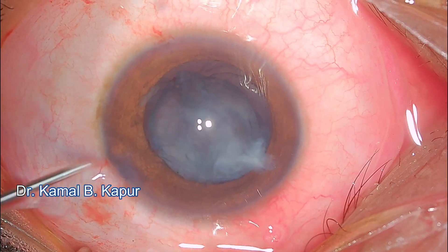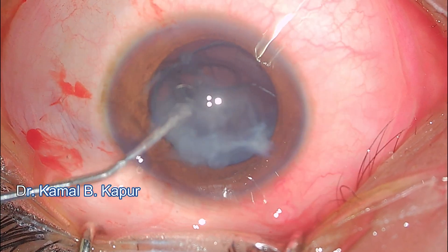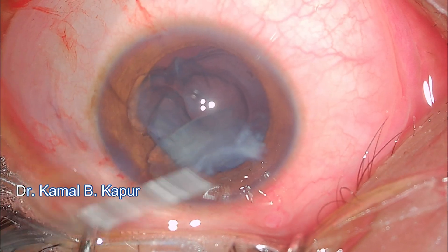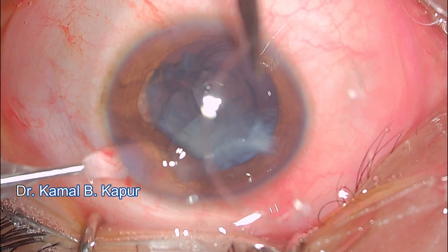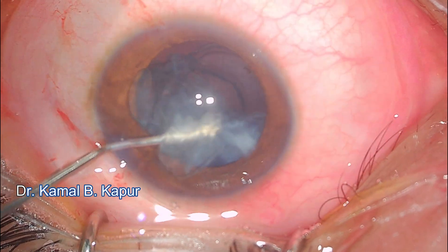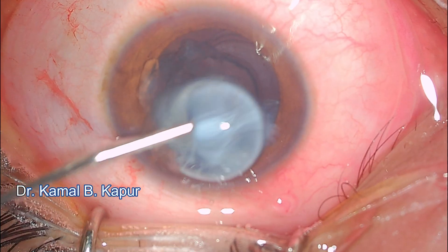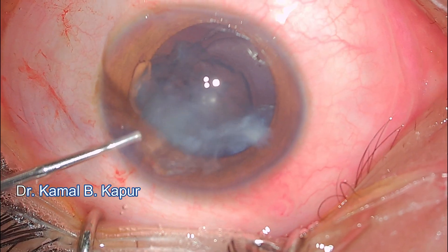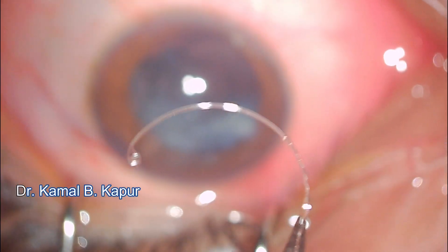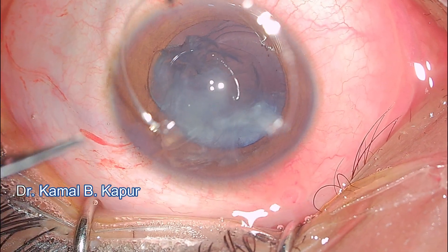I use viscoelastic to push inside the capsular bag and express the cortical and cataractous matter. The more material I can express out using viscoelastic, the safer it is, because during irrigation-aspiration I don't want to go into the capsular bag and perform many manipulations there. Pushing in the viscoelastic must also be controlled, lest you create more zonular break and more subluxation.